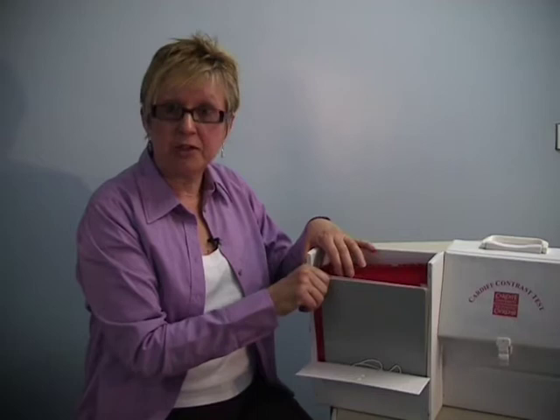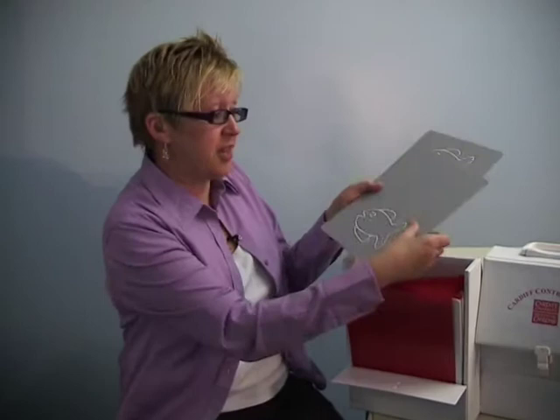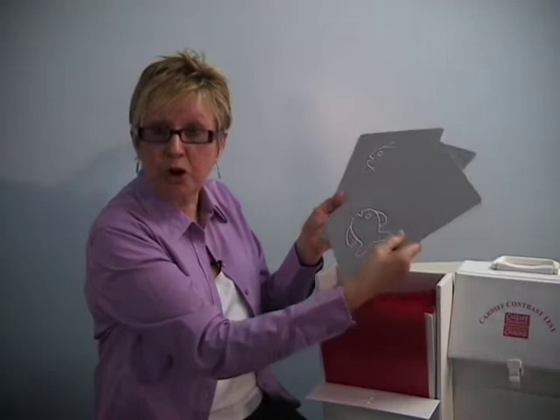The overriding principle of preferential looking is that the examiner should not know in advance where the picture is, because it's very easy to be biased and expect a child to look in a particular direction — we need to be objective. We achieve this by having three cards at each level: two at the bottom, one at the top, or vice versa. We shuffle the cards to begin with, so with a few shuffles I now have no idea where the picture is going to be.